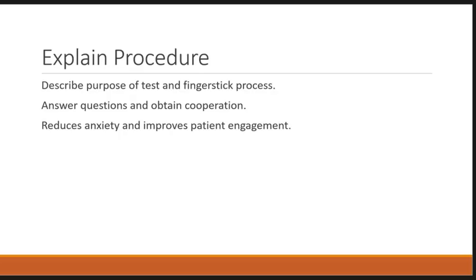The nurse should explain the purpose of the glucose test, describe what the patient can expect during the fingerstick procedure, and answer any questions. Now, if the patient is a diagnosed diabetic, they probably know all about the process and the procedure, but according to protocol, you should do this each and every time. Clear communication helps reduce anxiety. It promotes patient cooperation and demonstrates respect for the patient's right to participate in their health care. And how you know that a patient understands completely what's going on is when they submit their hand for you to evaluate for the fingerstick procedure.